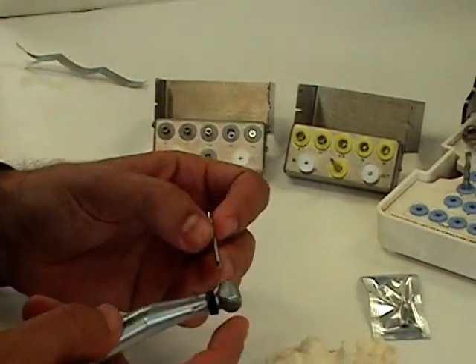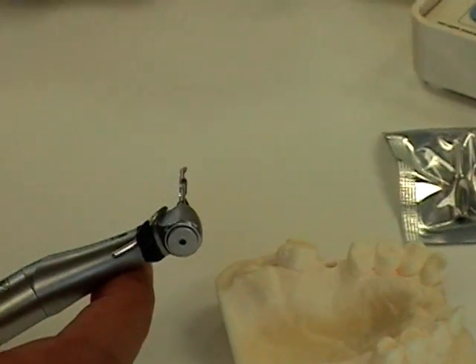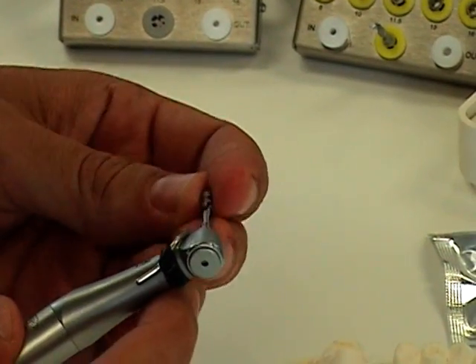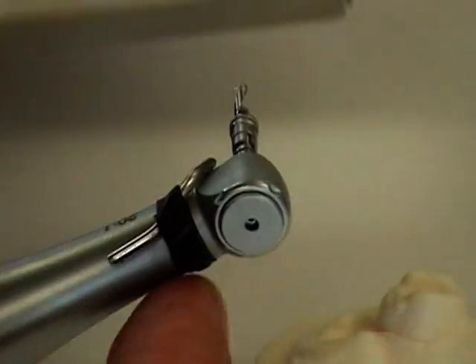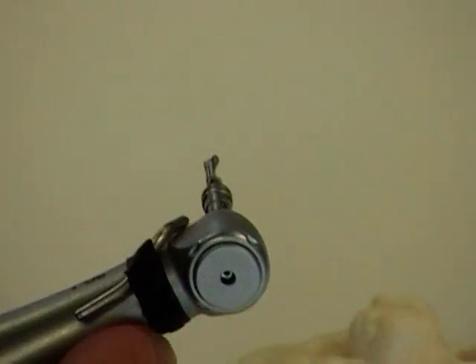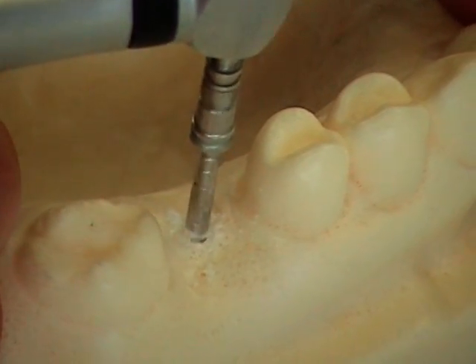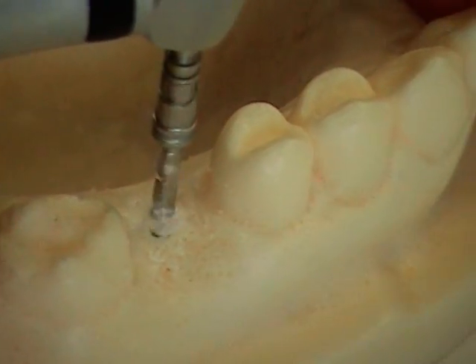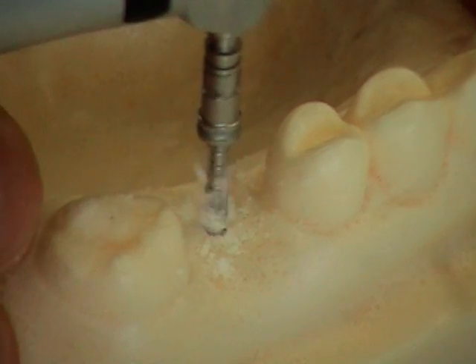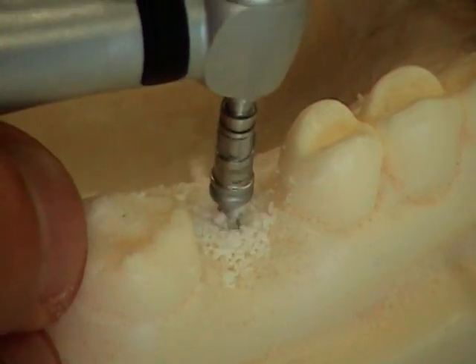Next, the 2.0mm drill, which we'll use with the 13mm drill stopper. Push in to keep the drill stopper in place. It is best to drill with in and out motions to prevent the drill from overheating and burning the bone.